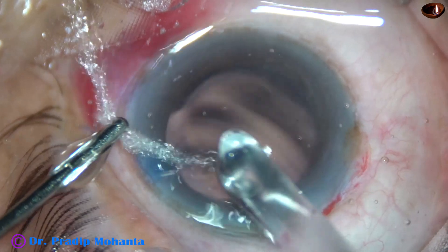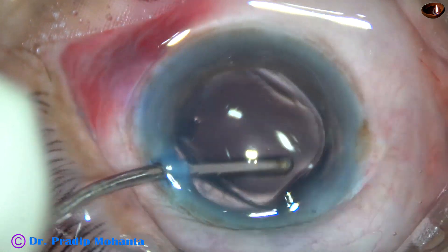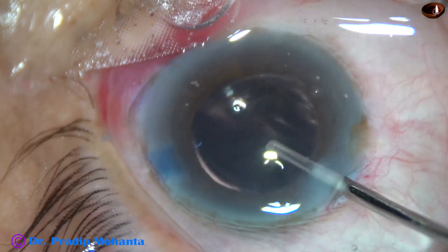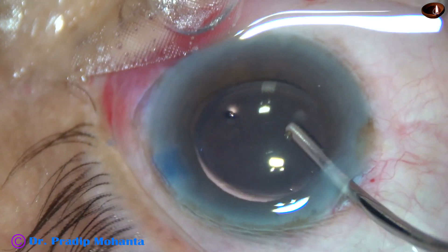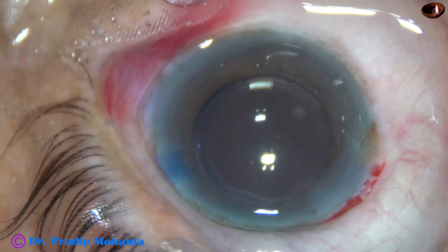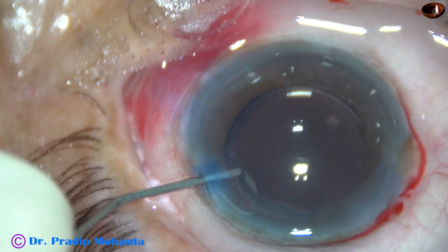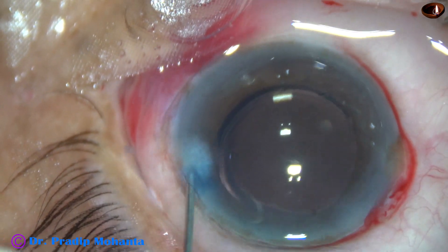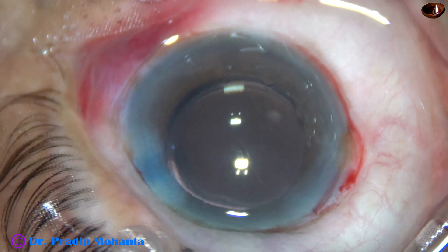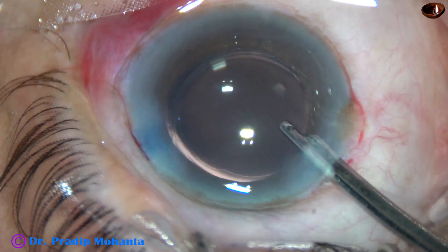And now hydro-implantation of a single-piece monofocal intraocular lens is done. Whatever viscoelastic is in the lumen of the cartridge is irrigated out. A bit of moxifloxacin is injected into the anterior chamber. Hydration of corneal stroma on either side of the side port is done. The case is complete; we just have to do a final lavage of the anterior chamber.